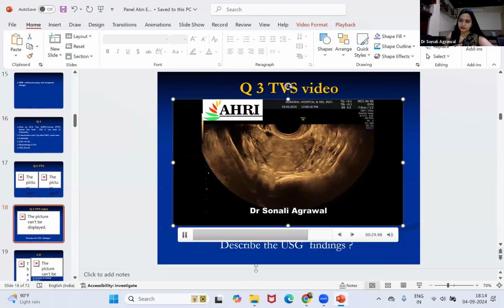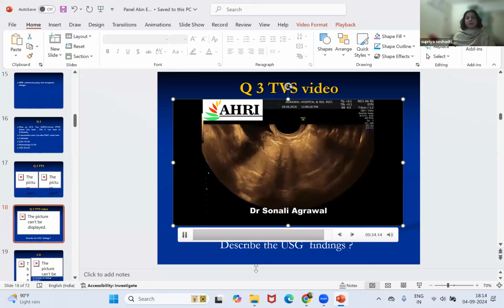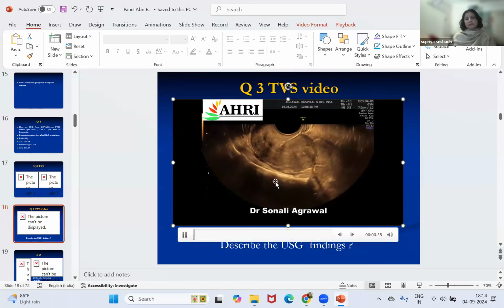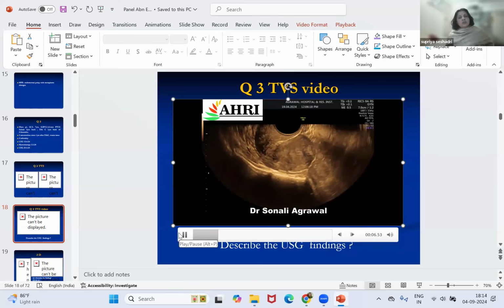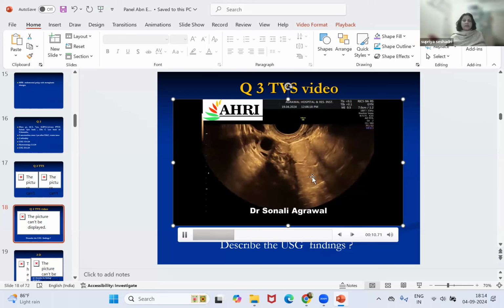Supriya ma'am, would you like to add on this? I quite agree with what's been said. Only, I see this hyperechoic area, which makes me think of synechiae. Since I have my leanings more towards ultrasound, I will just go by what terminologies they use to describe.